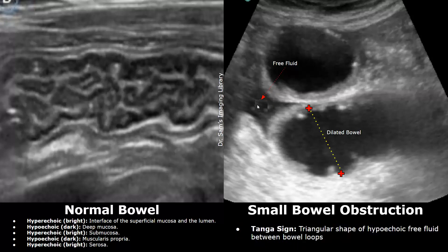This is another case showing the tanga sign. The triangular shape of the hypoechoic free fluid seen between bowel loops is called the tanga sign. It has a triangular shape and is often associated with small bowel ischemia or infarction.